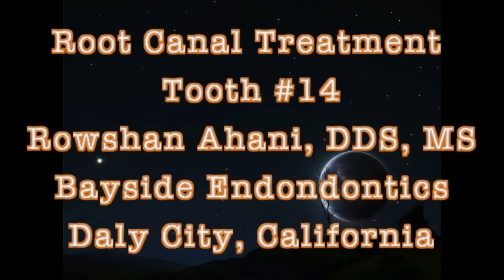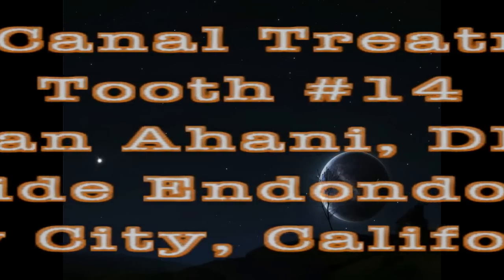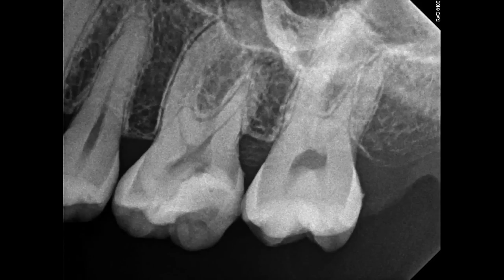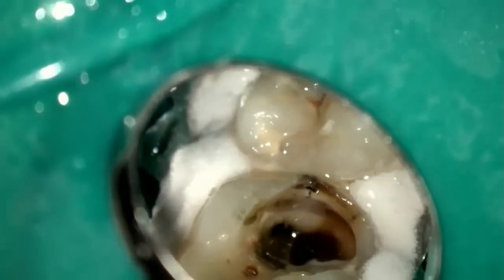I'm going to review root canal treatment on tooth number 14. This patient presented with symptoms of irreversible pulpitis with acute apical periodontitis. Review of the initial PA x-ray reveals a deep filling near the pulp and a composite filling. We initiated rubber dam placement, did some occlusal reduction, and proceeded with the access. I use a black diamond burr for access — it allows me to dig apically as well as remove material laterally, and I like the way it makes straight walls.